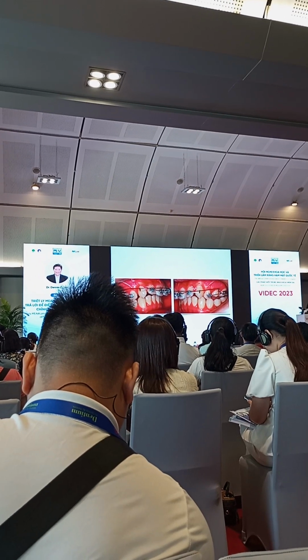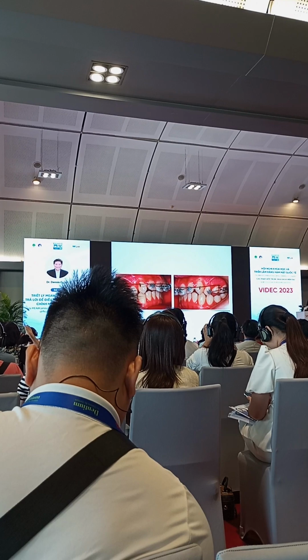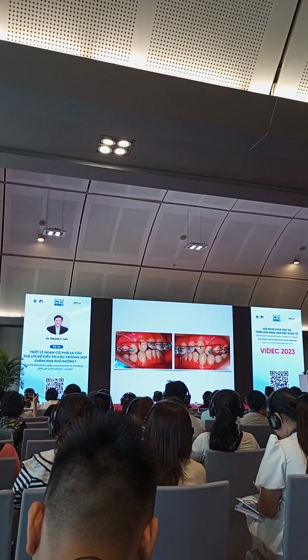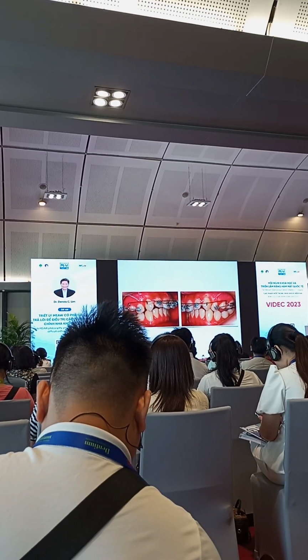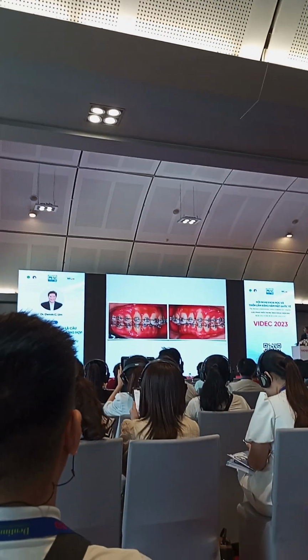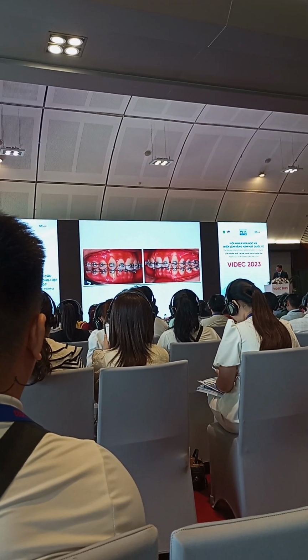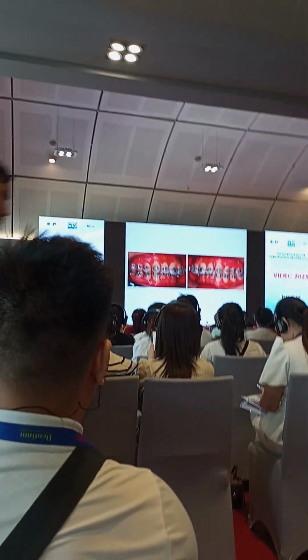So this is after a few more months. You can see now that the incisors are more upward. You just leave the canine, which now looks a little bit longer because you are trying to intrude the four incisors. And once all the permanent teeth have erupted, then you can already do the leveling and alignment during this time. You do level and align to be able to make the canine level with the incisor.